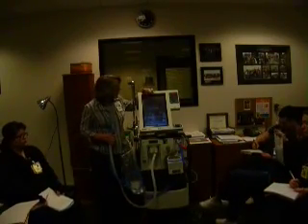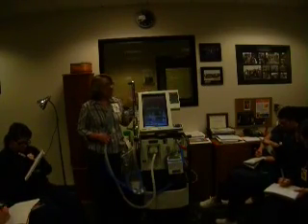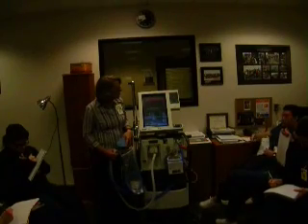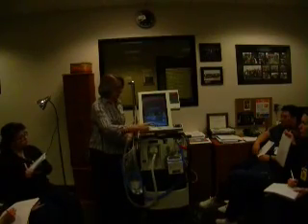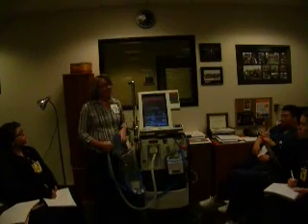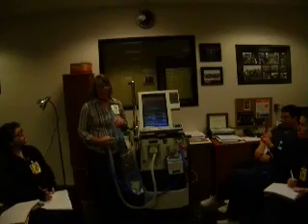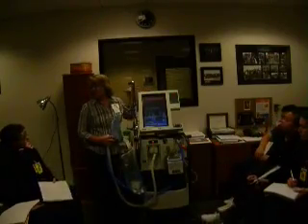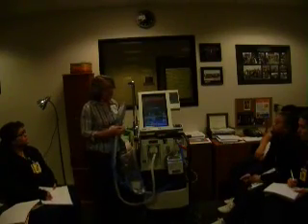You'll see up here in red are your alarms. Red alarms are high priority alarms. They also sound different. Oh, I got it silenced, sorry. You'll hear that. You'll get to know your ventilator and your alarms, especially depending on where you go work. I'm going to show you the differences in the alarms, but this is high priority. You can tell by the sound of it. Also, anything that comes up in red on the screen is high priority. That means you get in there and you get in there quick because there's a serious problem with the ventilator and you need to find out what it is.